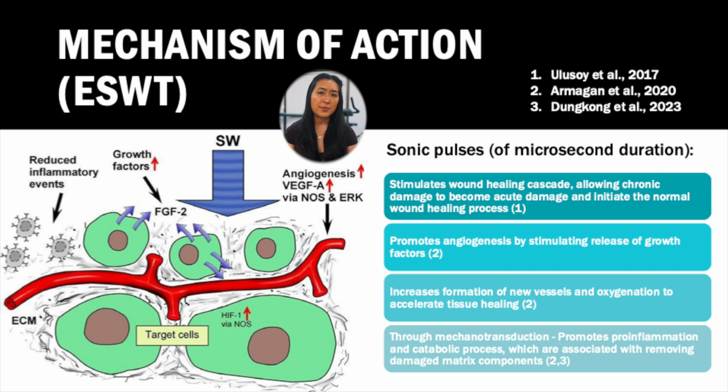While it is pro-inflammatory, these sonic pulses can also help to inhibit pain receptors in the targeted area, and the microinflammation that these pulses trigger stimulates a process called mechanotransduction. Mechanotransduction is the process by which these sonic pulses place mechanical loads on the cellular cytoskeleton, and this in turn induces signals for cellular repair through the release of growth factors and increases the formation of new vessels and oxygenation to speed up tissue healing.